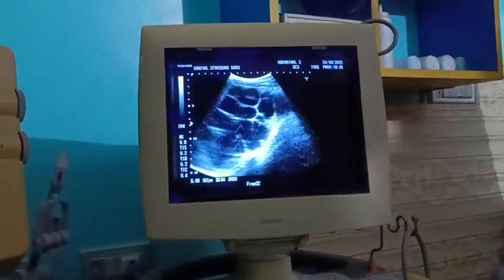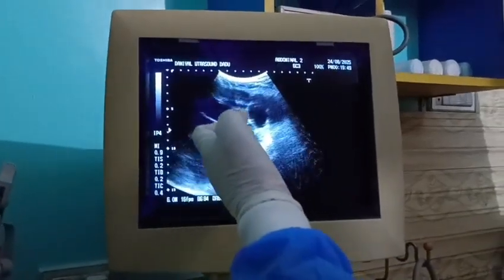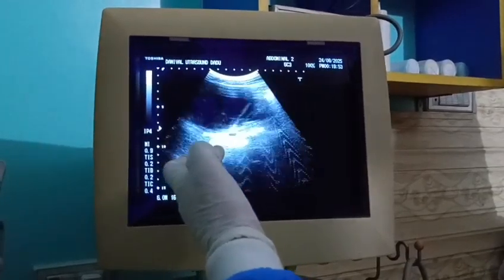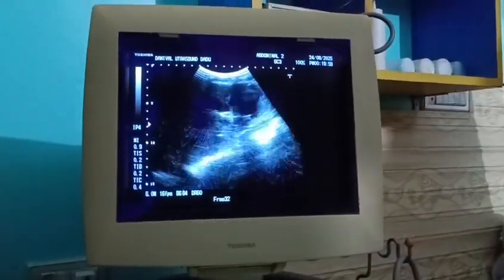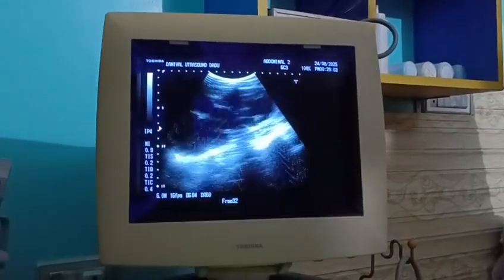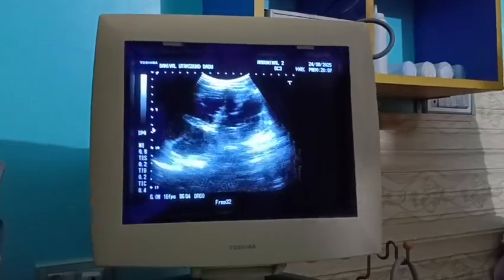This case shows a severely hydronephrotic kidney. Here you see the calyces are severely dilated, and there is a loss of corticomedullary distinction as well. A paper-thin cortex is seen here. The calyces communicate with each other. You see communication is there. So this is a severely hydronephrotic kidney.